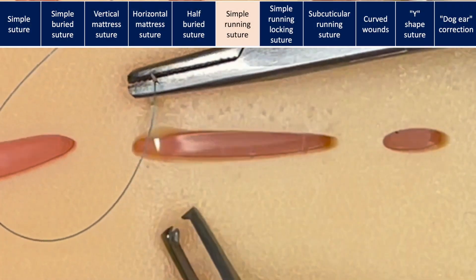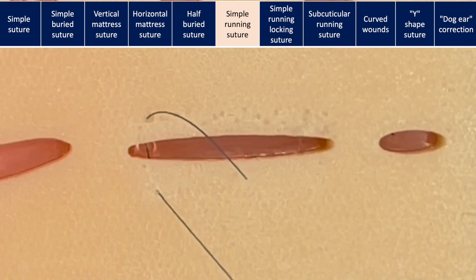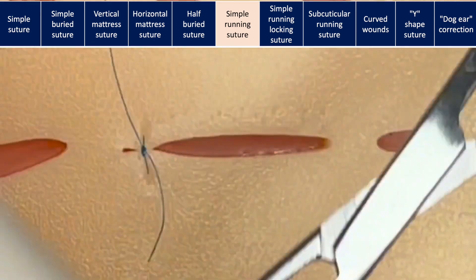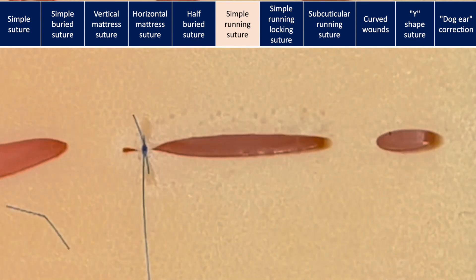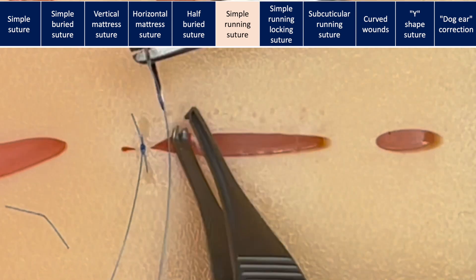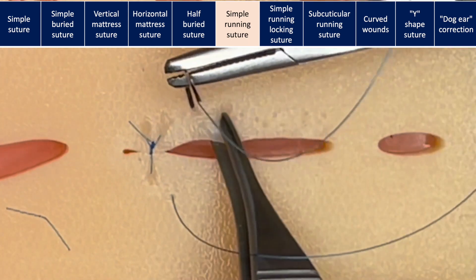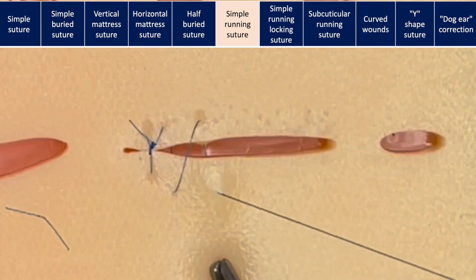This is a simple running suture. We're going to start with a simple suture and tie the first one with an instrument tie. Make sure your suture is the right length for the task — long enough for the job, but not so long that it becomes difficult to handle. Now we're going to move along the same distance each time. You enter the skin on one side and on the opposite side, enter just in front of the exit. Don't forget to take a 90-degree bite each time to evert the wound.